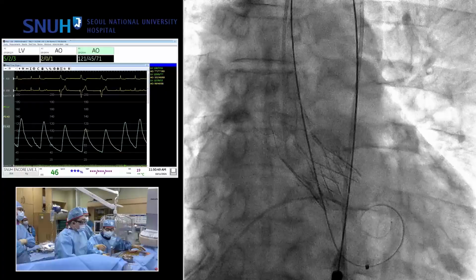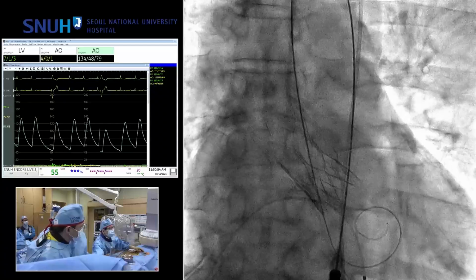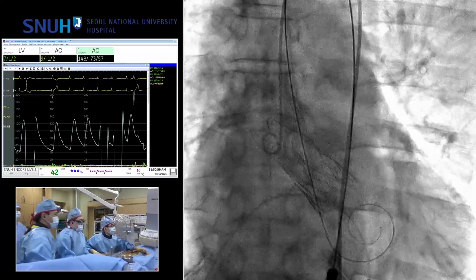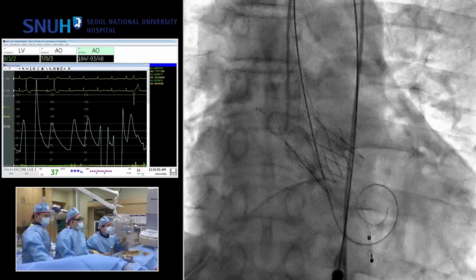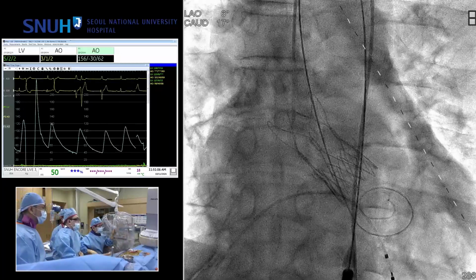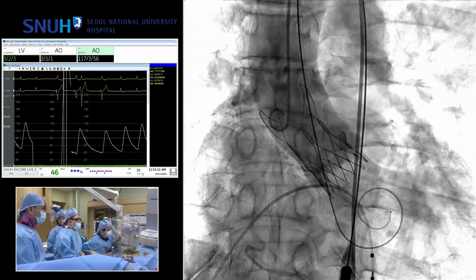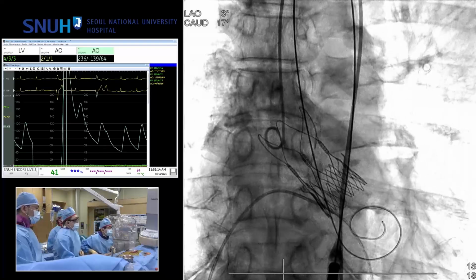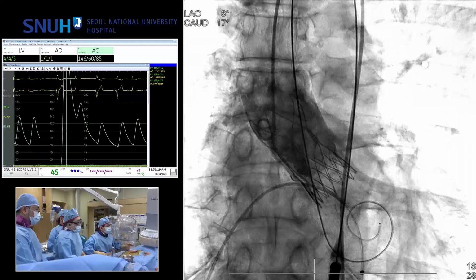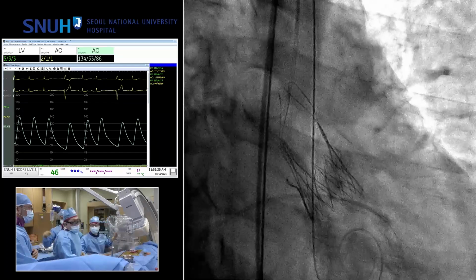Let me show you the angio. 89 years old male with baseline first degree AV block, sometimes complete AV block, now high degree Wenckebach block. There is some regurgitated paravalvular leakage. Can you see? In LAO, the left cusp, maybe because of the post underlying calcium.